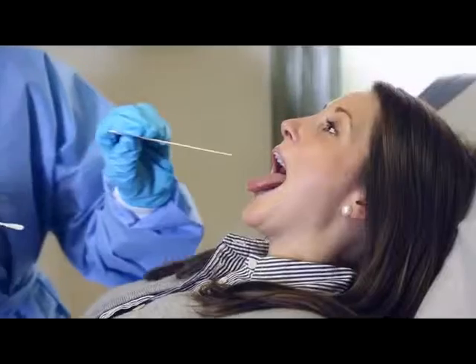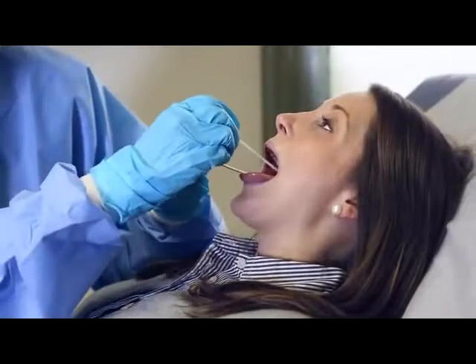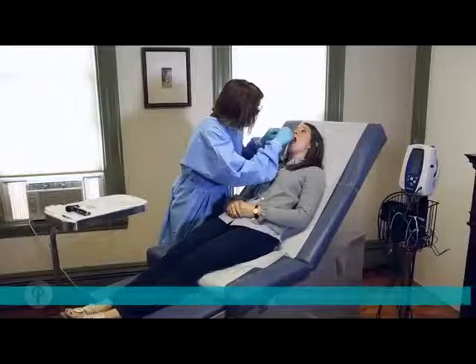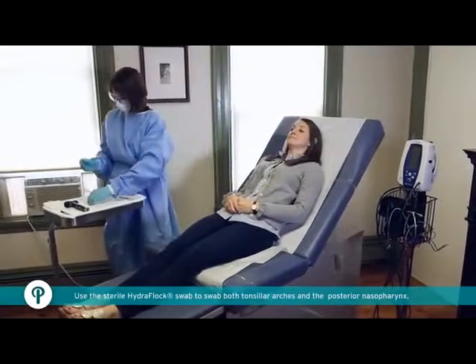Have the patient tilt their head backwards, open their mouth and stick out their tongue. Use the sterile HydraFlock swab to swab both tonsillar arches and the posterior nasopharynx without touching the sides of the mouth.